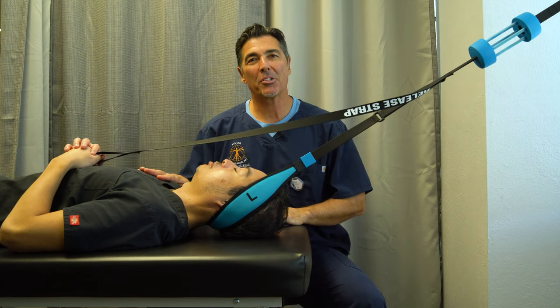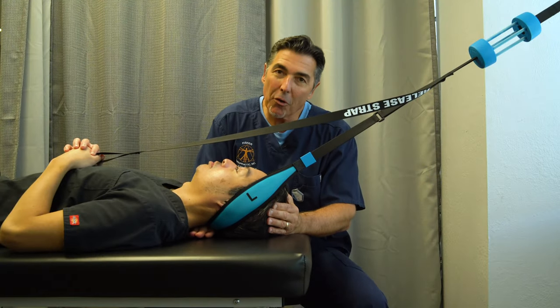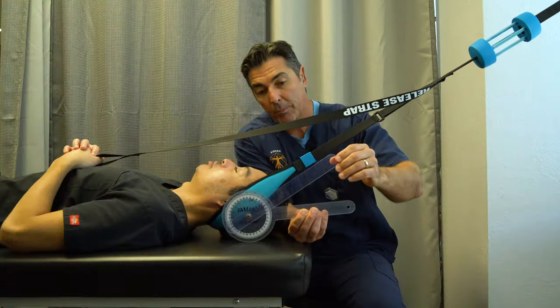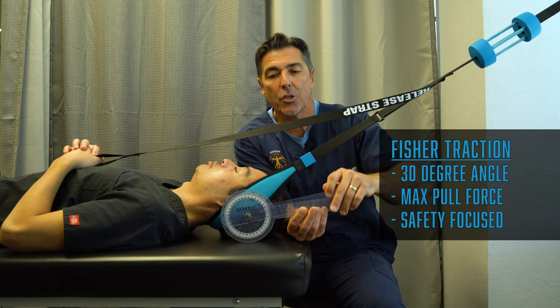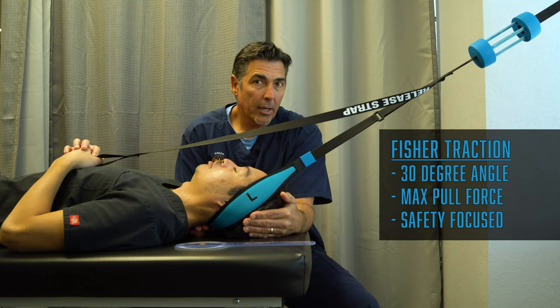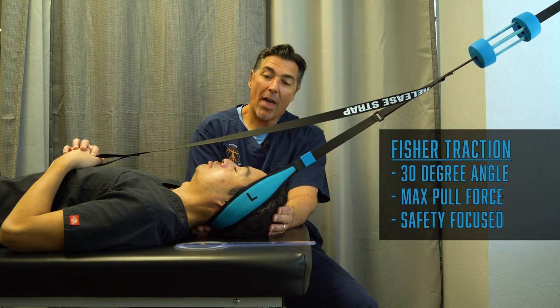We'll show you examples of how Fisher Traction is different — how it helps maintain and actually create more curve where other devices do the opposite. We have Ram here, our physical therapist. You can see I can put my hands right underneath his neck, so the curve is maintained and his head is still resting on the ground where his muscles can relax. The angle of pull is really important — about 30 degrees, which is the ideal angle to address the middle of the neck up towards the occiput, covering the whole neck while maintaining and promoting that curvature.